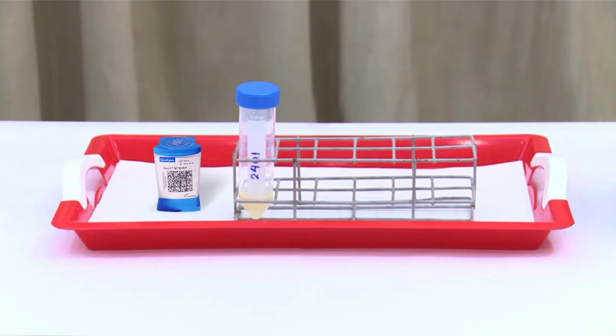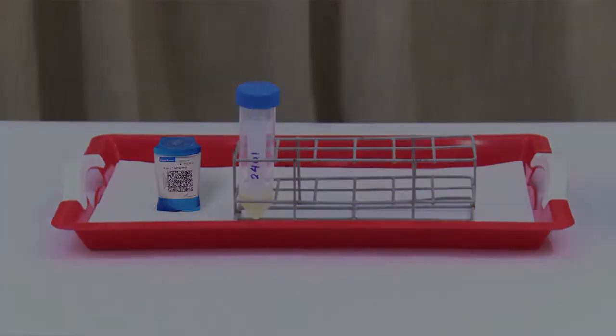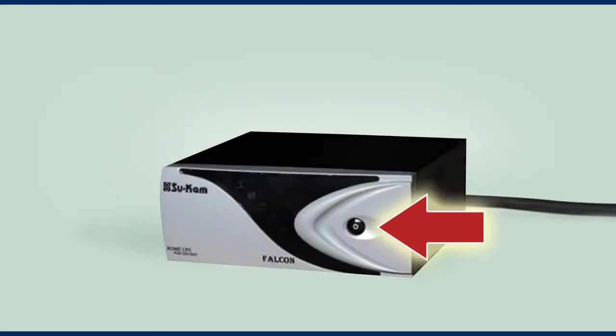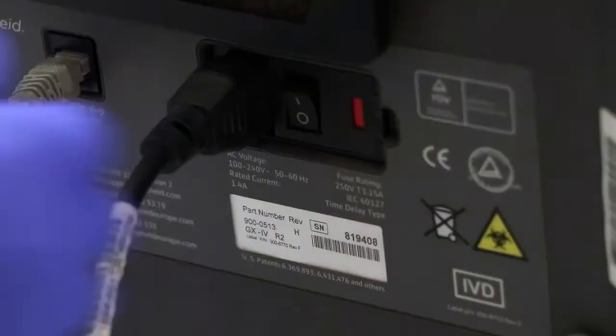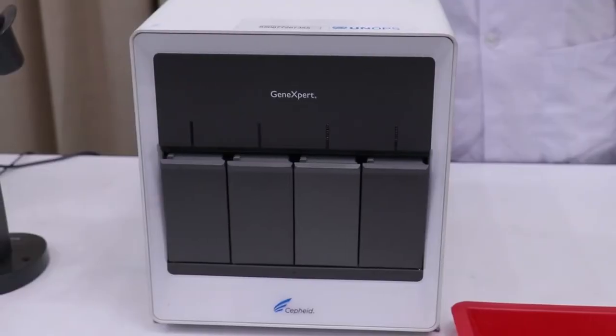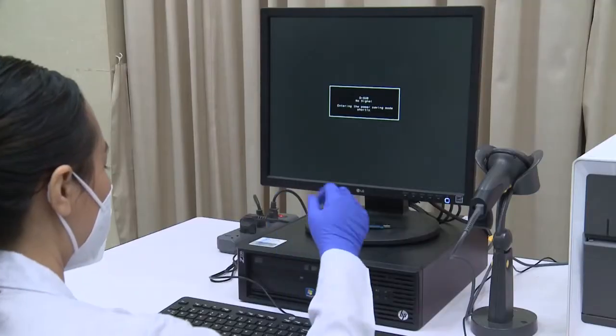To load the GeneXpert cartridge on the machine, switch on the main power source, switch on the UPS, and then switch on the GeneXpert machine. Make sure the green light appears on the Xpert machine.